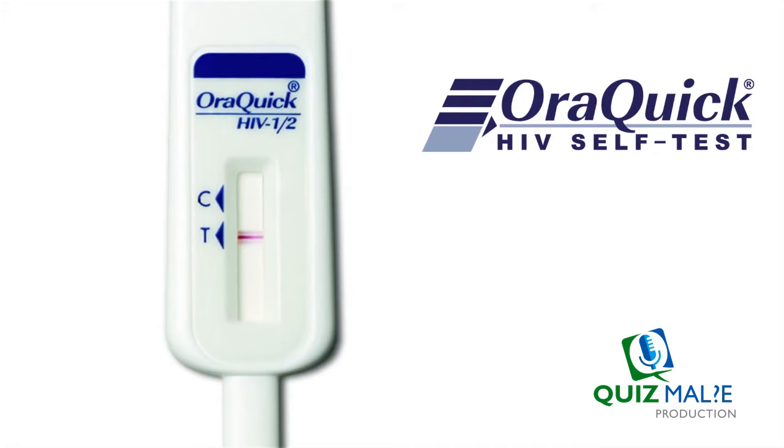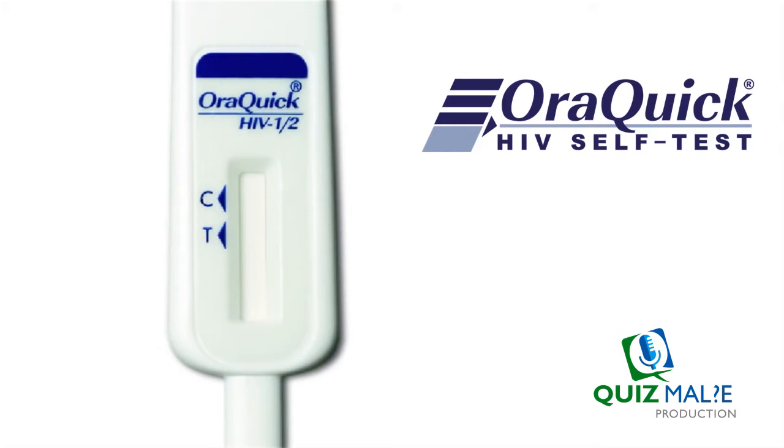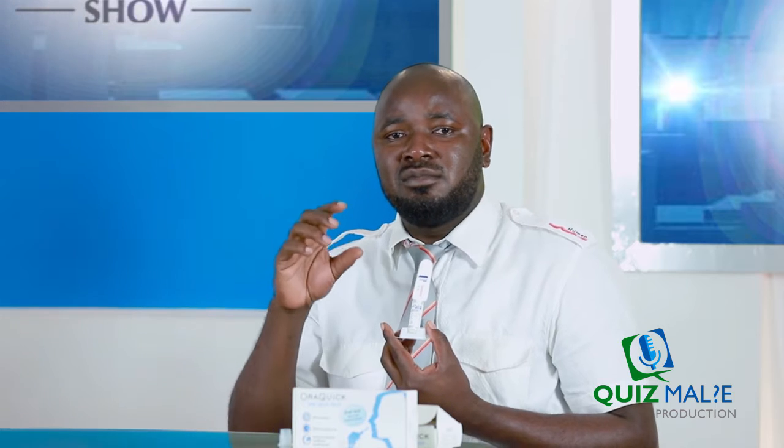Now, if the test is negative, then right here where there is T, there will not be any line, so you only have a single line against the C. But if the test turns out positive, there is a line that will appear against the T. So you'll have two lines. That means your test has tested positive. It can be a very visible line, or it can be a very faint line. Whichever, it still means the test has tested positive.